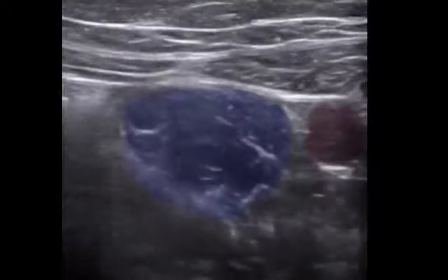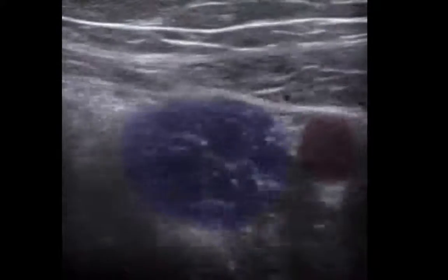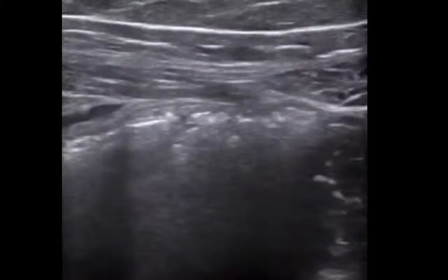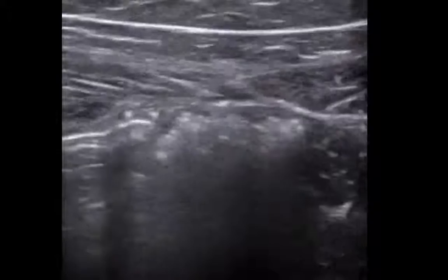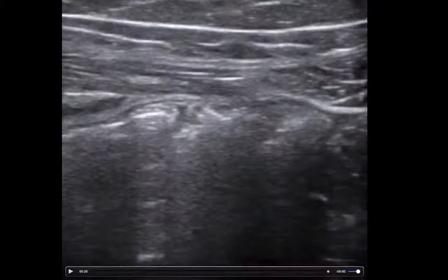The psoas muscle is going to be the most posterior aspect of the box that the appendix should be in. The iliac artery is going to be the most medial aspect, and the iliac crest is going to be the most lateral aspect. Right here, see this kind of lumpy, bumpy shadow right here? This is colon, and I'll talk about why that's important later.